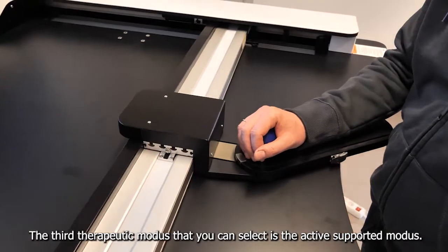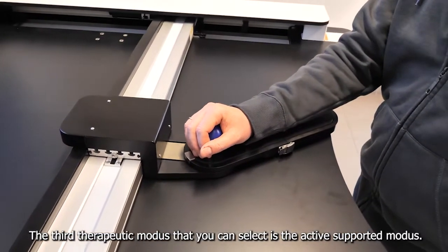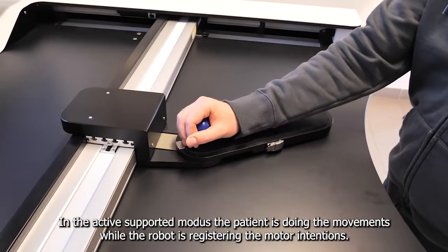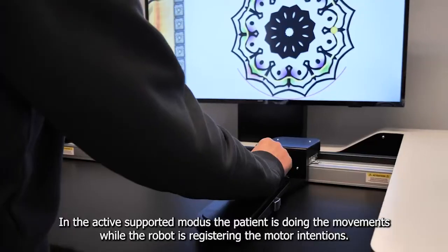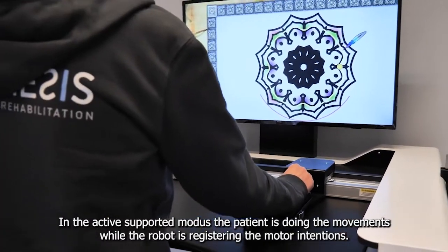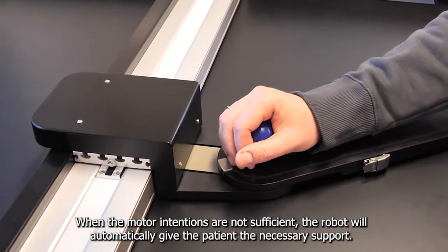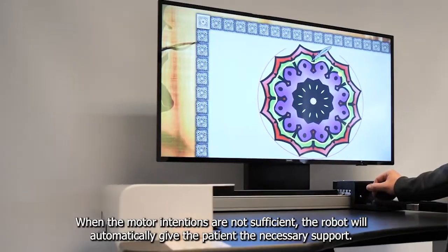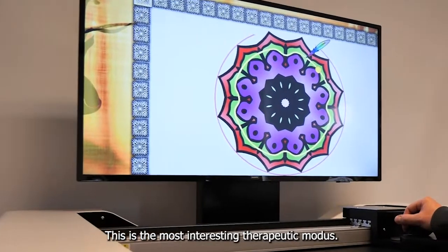The third therapeutic mode you can select is the active supported mode. In the active supported mode, the patient is doing the movements while the robot is registering the motor intentions. When the motor intentions are not sufficient, the robot will automatically give the patient the necessary support. This is the most interesting therapeutic mode.